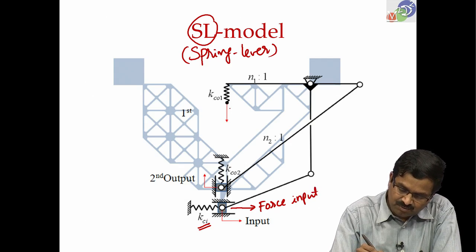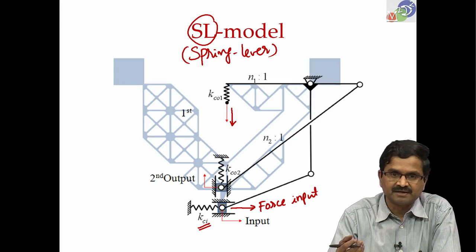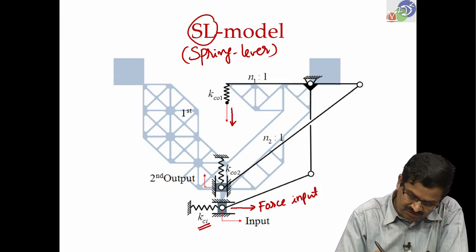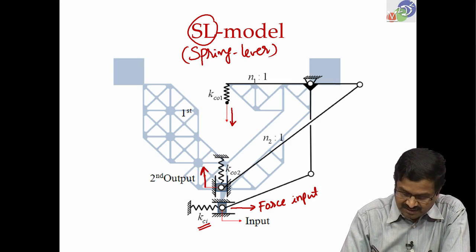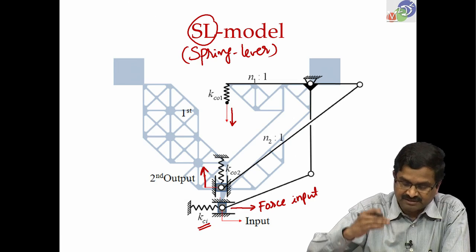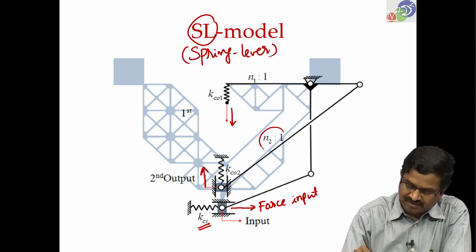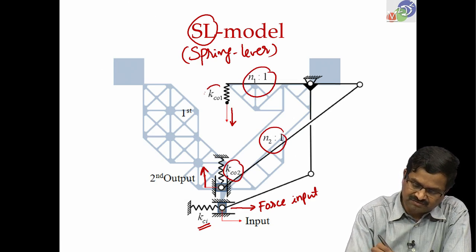One is that this point moves like this to indicate the displacement and to indicate the force directly. At the same time, this point actually moves up as it is shown. So, retraction. There is a knife edge that retracts without cutting. So, we can make this model. There are now two leverage ratios, and there are two output side stiffnesses.